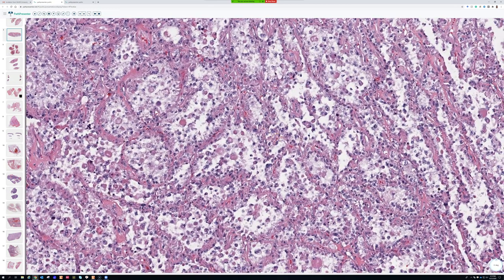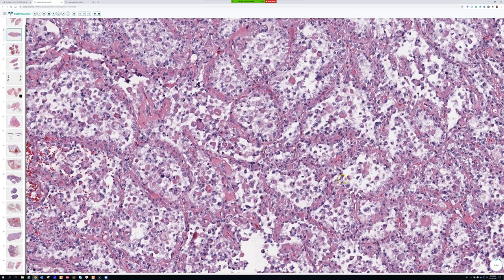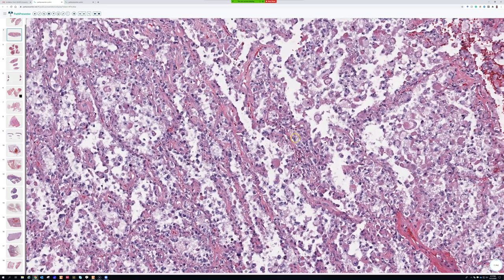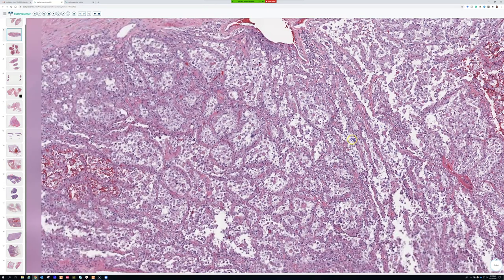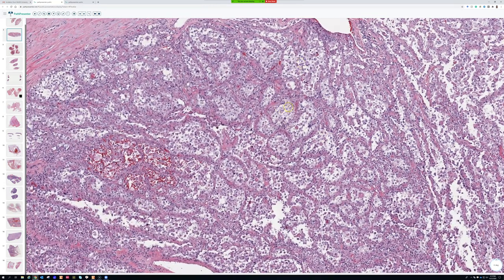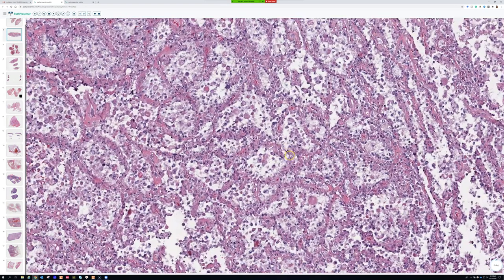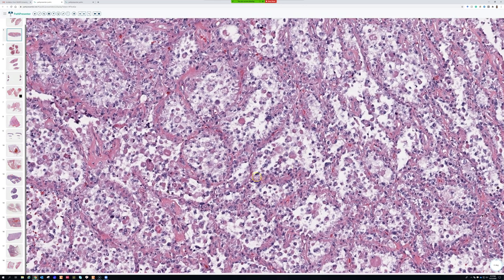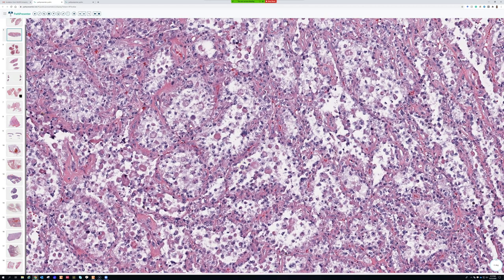The biggest differential is metastatic renal cell carcinoma, because some forms of RCC can have a lot of overlapping features. The term 'alveolar' refers to these spaces that are open in the center and lined by cells on the outside, just like the alveolar air sacs in the lung. These tumors actually start as solid nests, and then in the middle the cells fall apart and become discohesive, while cells are retained around the edges where the vascular channels run — and that vascular channel between the nested structures gives it the look that mimics renal cell carcinoma.